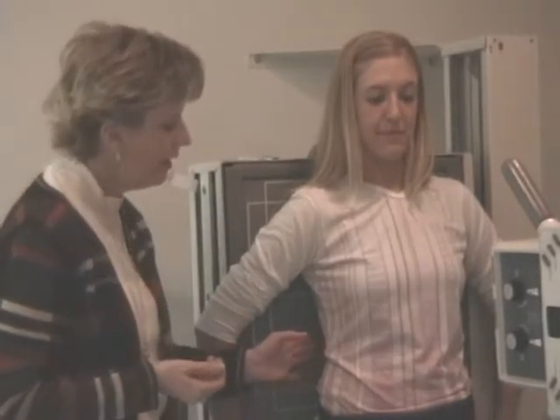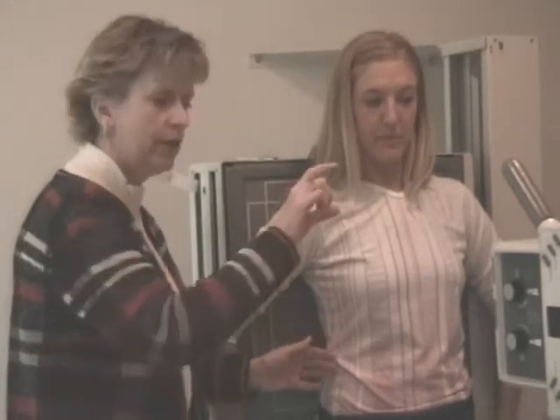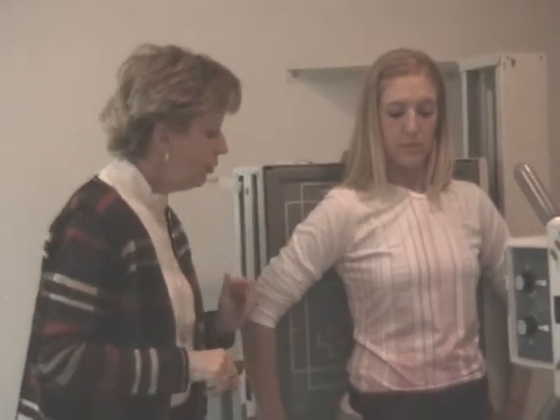If the patient's in a nice AP position, the spinous processes will be to the center of the film, and the ribs are in a very transverse position. And that would complete a rib series. We need to set up a couple of different scenarios now.